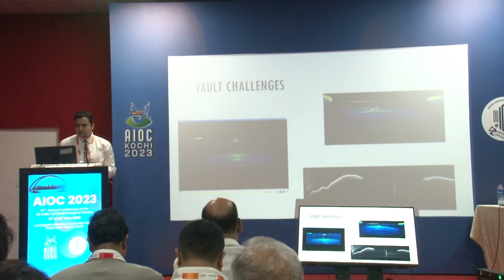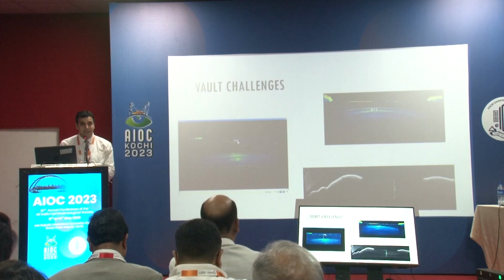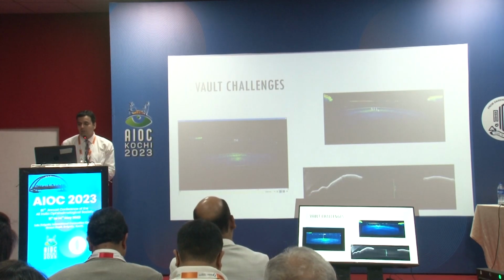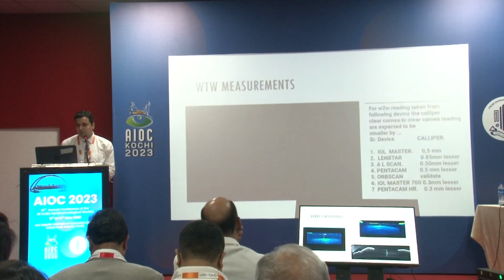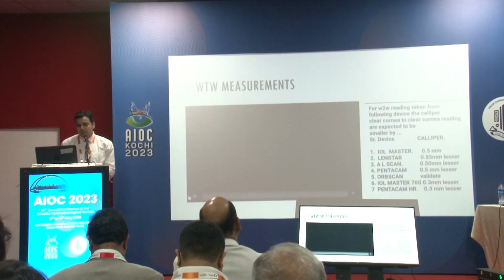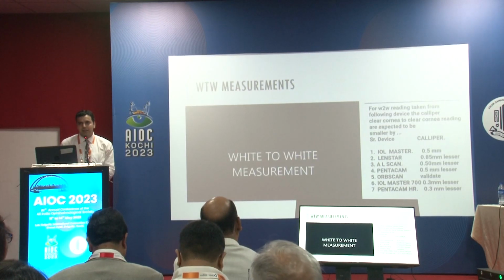The vault challenges: as I said, a normal vault, say 758, I would consider absolutely normal. In fact, a better vault. Smaller vaults like 119 would be low, and more than 1000 would be abnormal vaults.